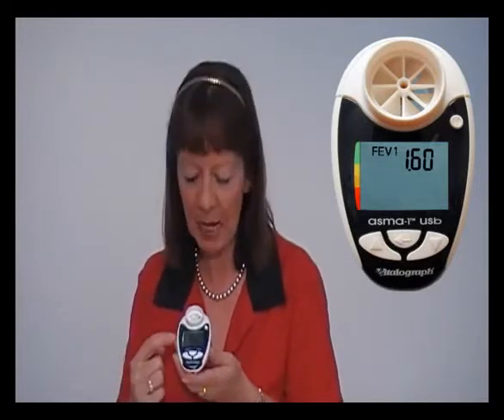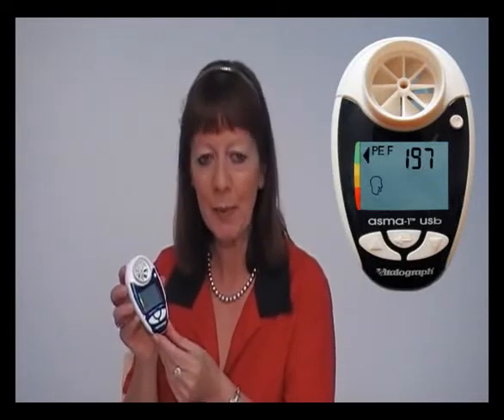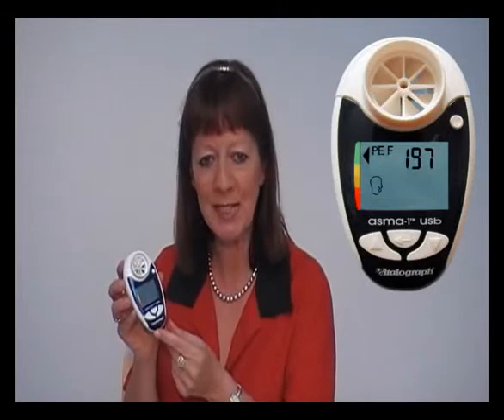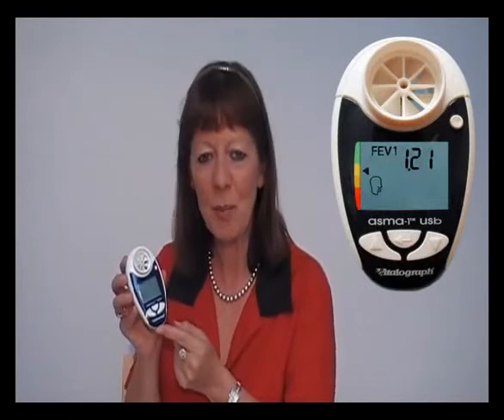When you have your own personal best programmed into the device, after every test it will now display an arrow on the left hand side of the screen to show which colour zone you are in, based upon percentage of your own personal best. Even the colour zones can be modified if necessary by a healthcare professional.